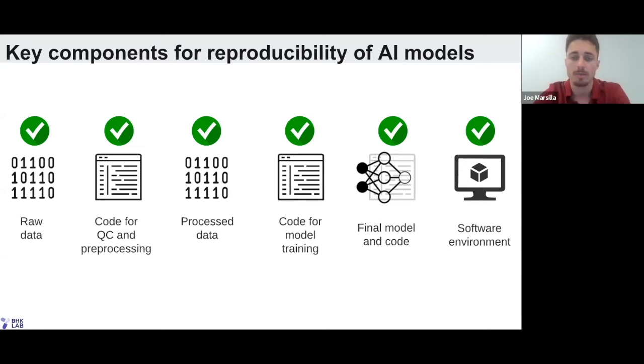When we extracted it, we just gave it as is, with the normal spacing as seen in the current patient image. The reason we wanted to do that is that when reapplying these contours and embedding them back into RayStation for planning, we need to conserve the spatial dimensions of the patient in terms of the XYZ planes.